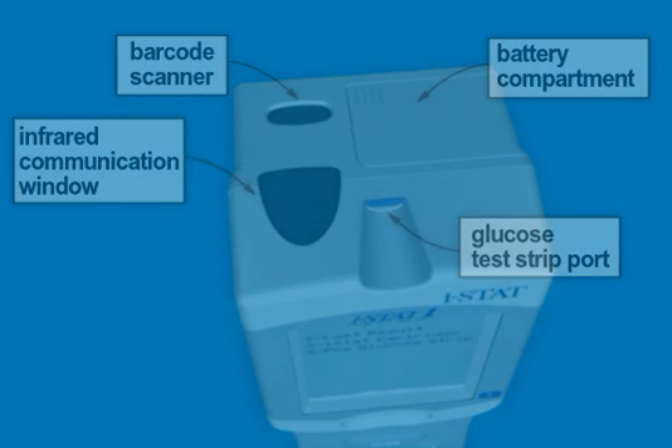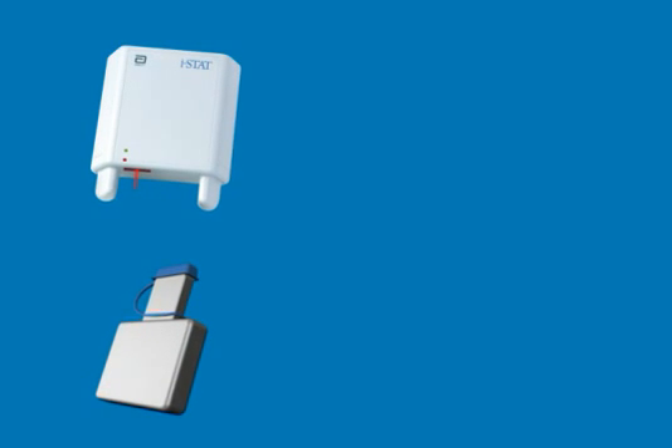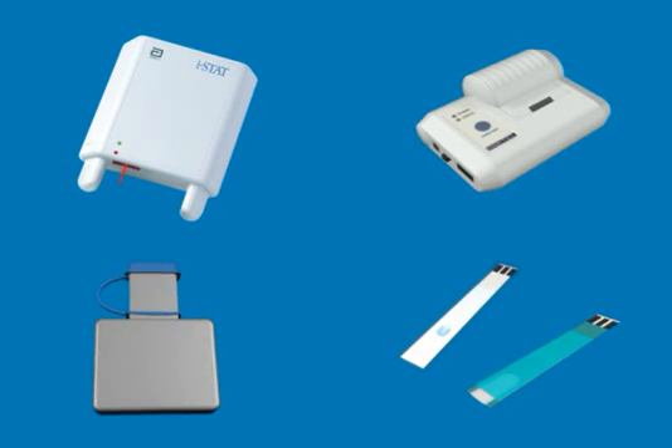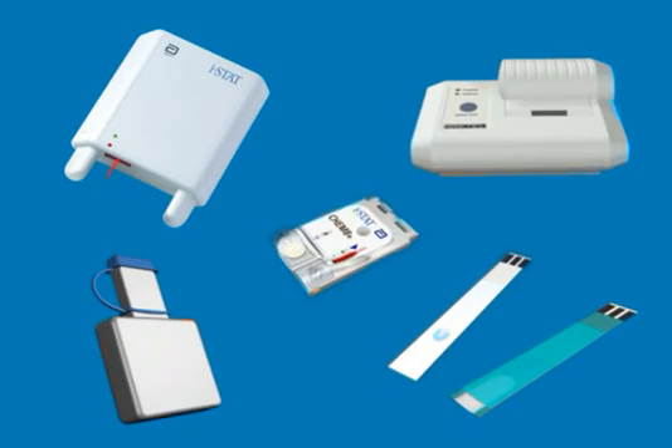Other major components are the downloader, an electronic simulator device, the portable printer, Abbott Precision PCX or Precision PCX Plus glucose test strips, and the ISTAT cartridges.